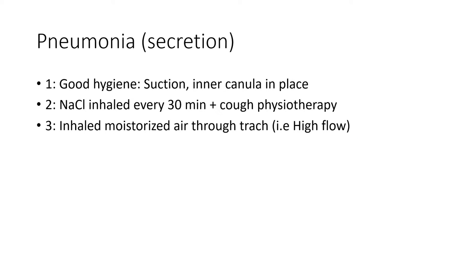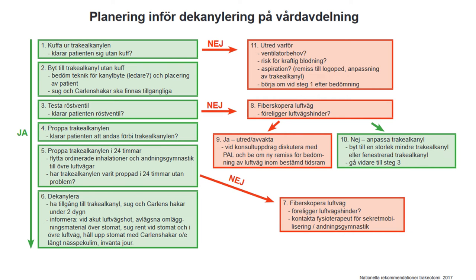The nurses that we talked to suggested that you could use high flow. You don't necessarily need the high flow, but you need the moisturizing of the air, and that's why the Optiflow device could be good for this. This is not anything I have from guidelines, I should say. This is from advice from nurses.